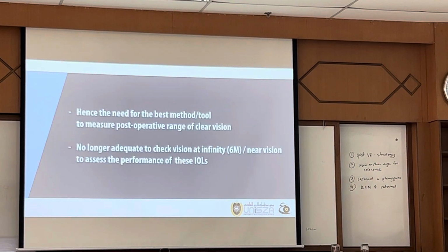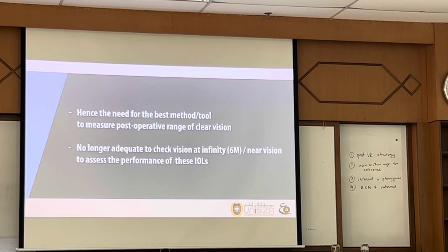So, like Dato' mentioned just now, there is a need for us to measure the range of clear vision provided by these IOLs. Some manufacturers will provide the defocus curve for the IOLs. So we, as end users, the surgeons, have to understand the defocus curve very well before we implant the IOL in the patient.